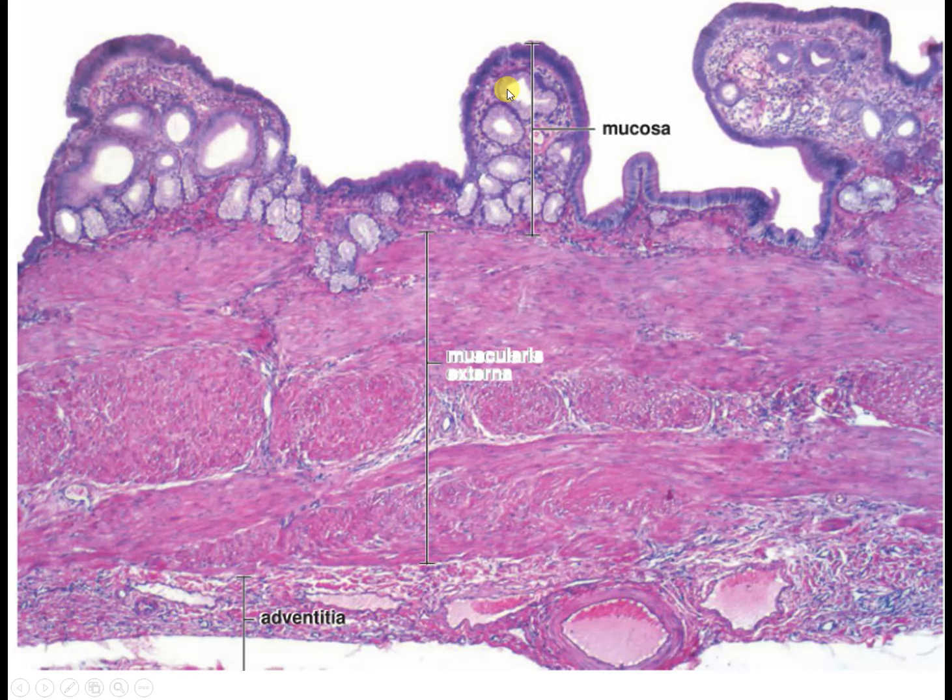That's the main portion, but it's not compulsory. Here we have mucosa without glands. So that way you see it's like a poor small intestine structure, simple columnar epithelium.